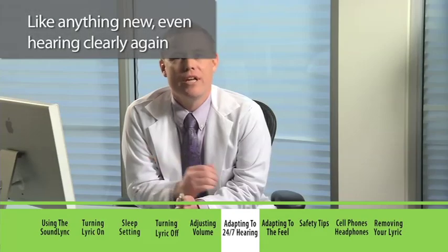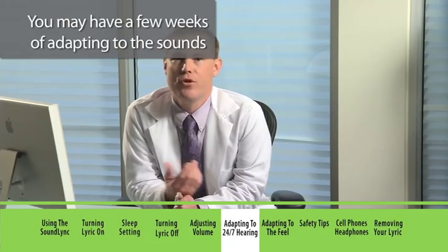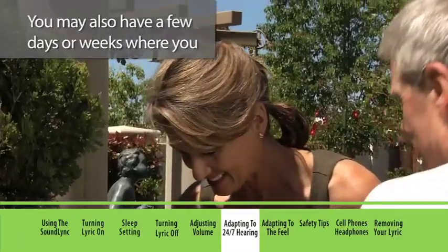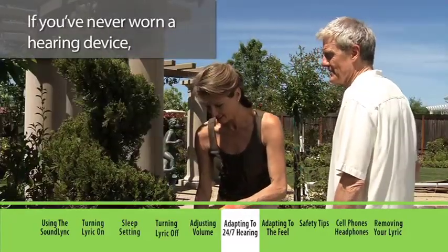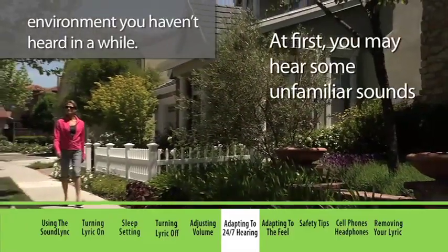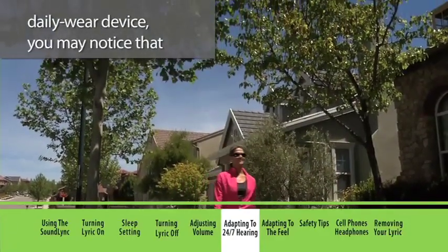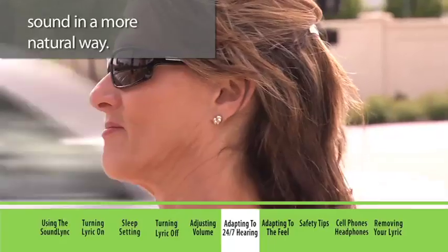Like anything new, even hearing clearly again with Lyric can take some getting used to. You may have a few weeks of adapting to the sounds of better hearing 24 hours a day, seven days a week. You may also have a few days or weeks adapting to the feeling of an extended wear device. If you've never worn a hearing device, you may hear some unfamiliar sounds at first — some of these will be sounds from your environment you haven't heard in a while. If you're moving to Lyric from a traditional daily wear device, you may notice that things sound different because with your Lyric placed close to the eardrum, you are now receiving sound in a more natural way.